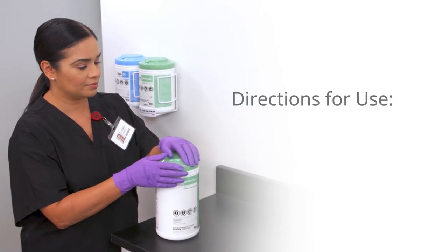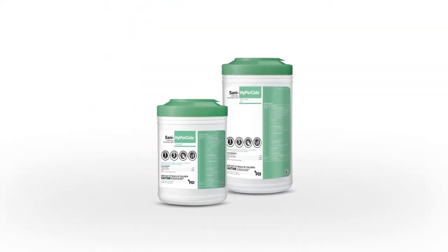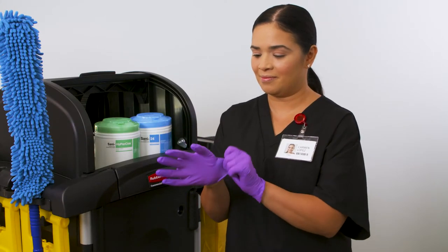In this video, we will show you steps for using Sani HyPerCide germicidal wipes for disinfection. When using Sani HyPerCide wipes to clean and disinfect blood and bodily fluids, be sure to wear gloves and other personal protective equipment as appropriate.